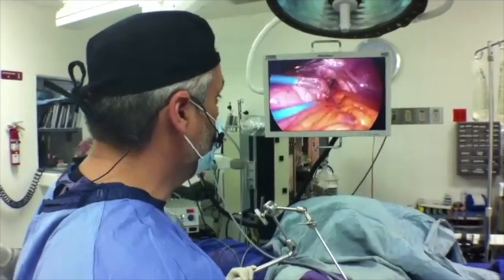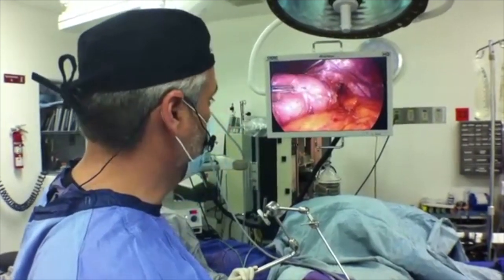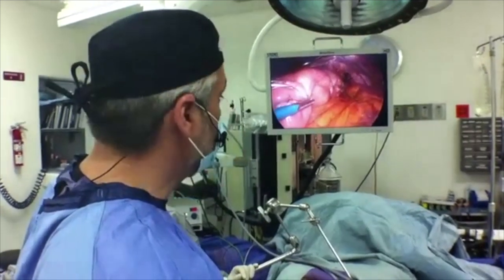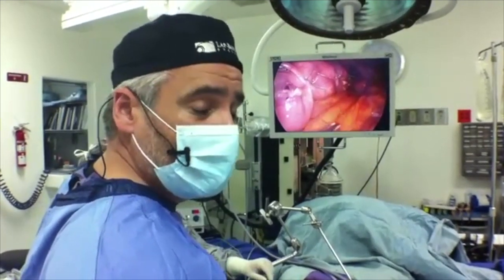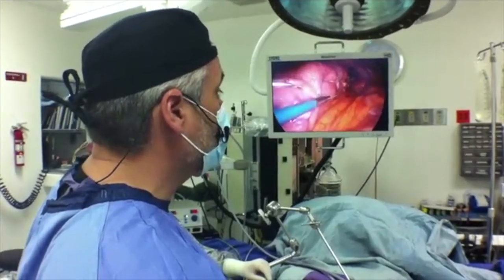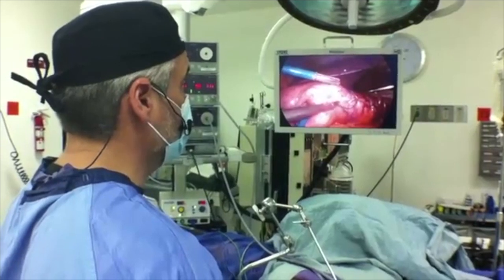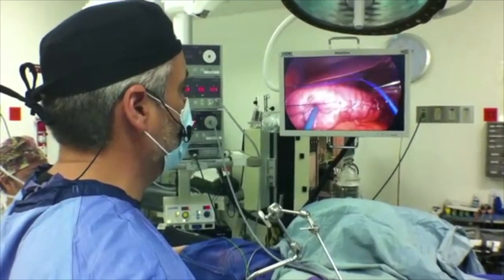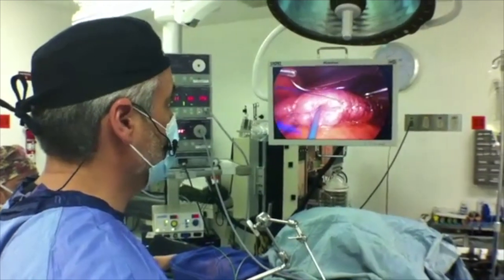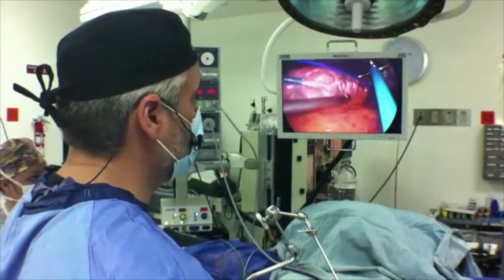We thought of this before. This combination is what we use for over 200 cases, and this is what the Brazilians have been using as well. Note that the way we stitch is sparingly and very lightly — this line of stitches does not hold the plication in place, that's the second line's job. Stitching very lightly also avoids ischemia. This is a continuous line of non-absorbent polypropylene sutures — a very strong stitch — and it is the containing stitch. Since it's a running stitch, it does not cause ischemia.